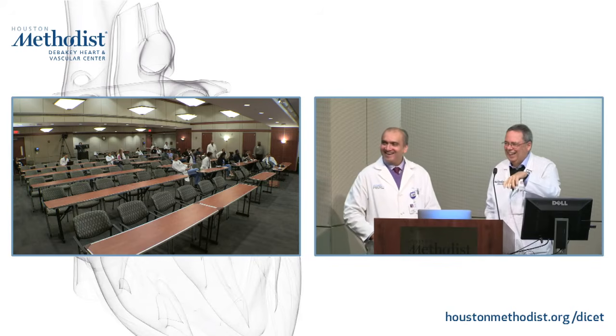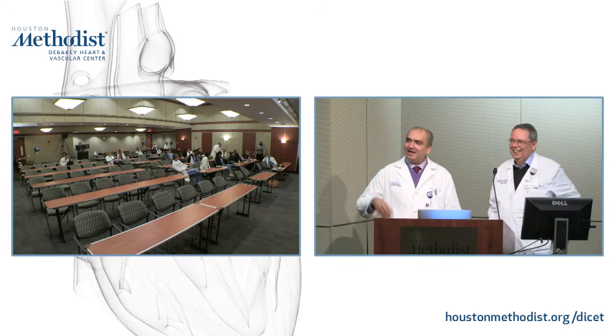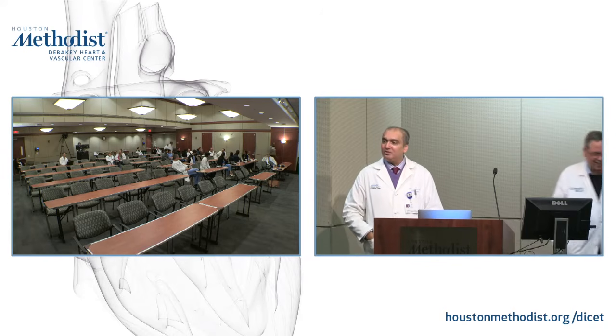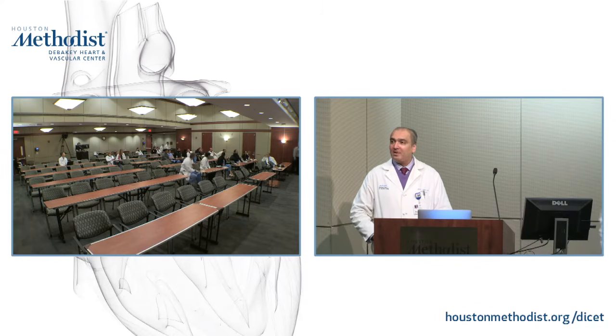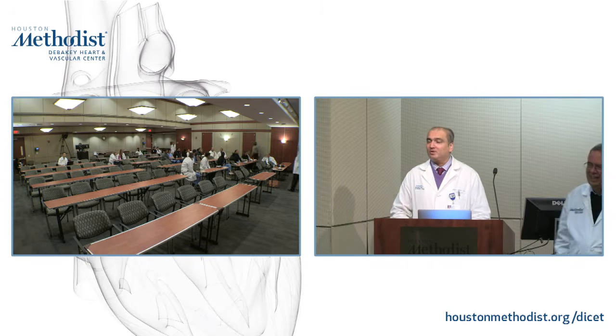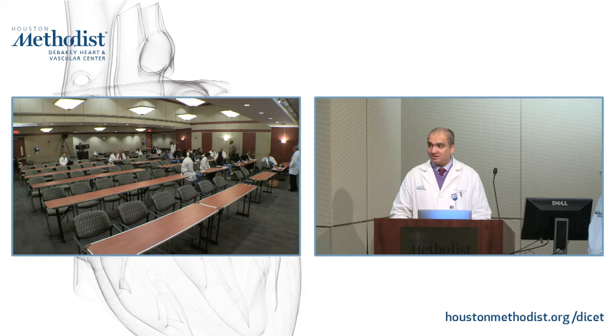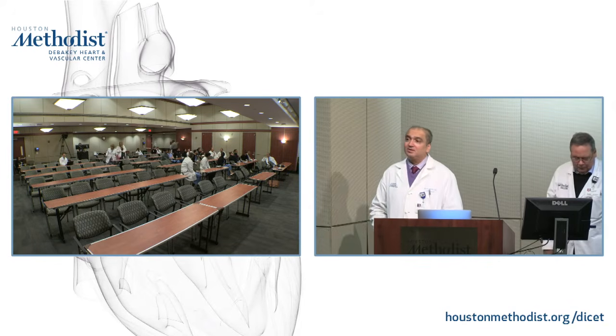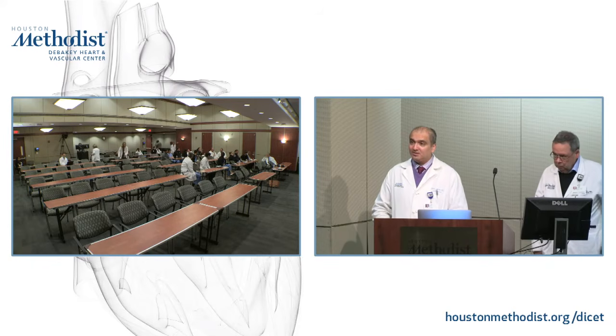Particularly for sarcoid or whatever. Yeah, I think sarcoid and amyloid probably are the two. I think sarcoid will have a more established role for PET in applications. We scanned many patients with sarcoid by MRI and PET, and there are some patients who are positive by MRI, which indicates that they had cardiac involvement.